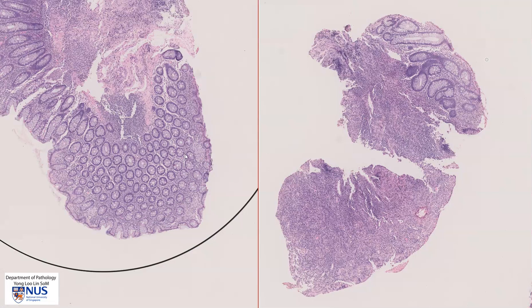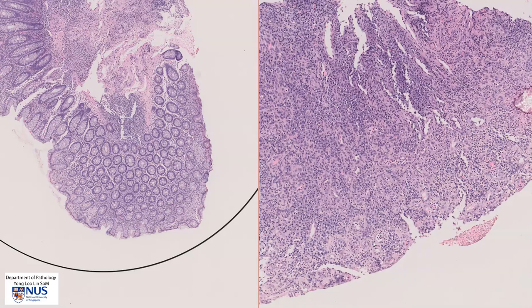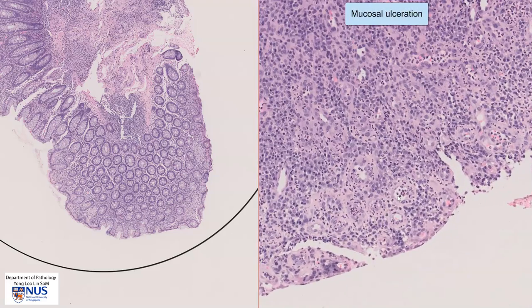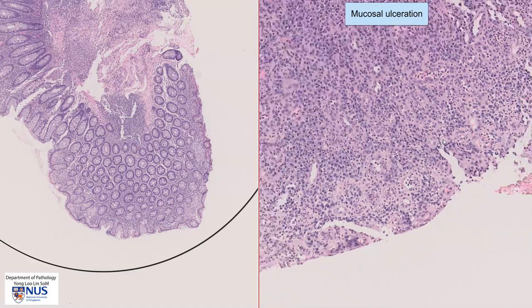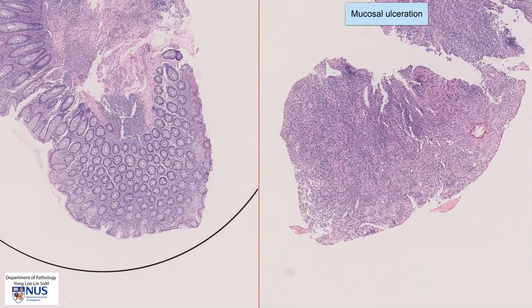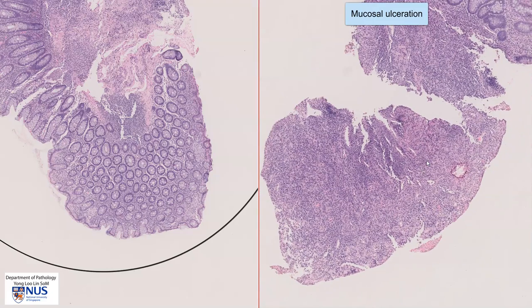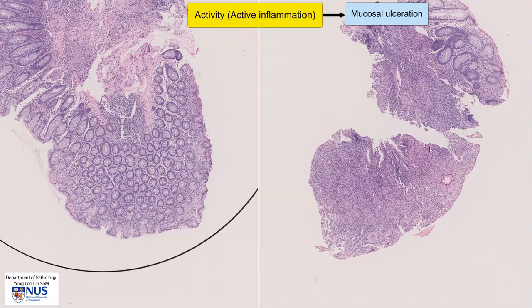Here, side by side, are two other examples of Crohn's disease, and both of these are small biopsies. Let's first take a look at the example on the right side — this is a piece of colonic mucosa. Over here we see mucosal ulceration with this ulcer bed, granulation tissue, lots of blood vessels accompanied by acute and chronic inflammation. So there is mucosal ulceration, which is a feature of activity or of active inflammation.